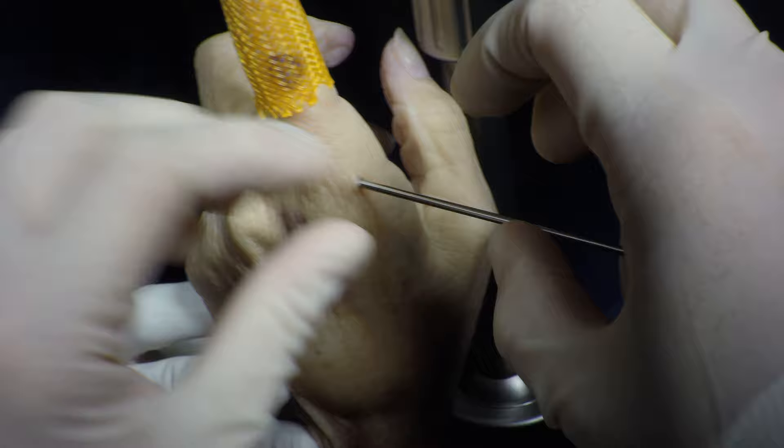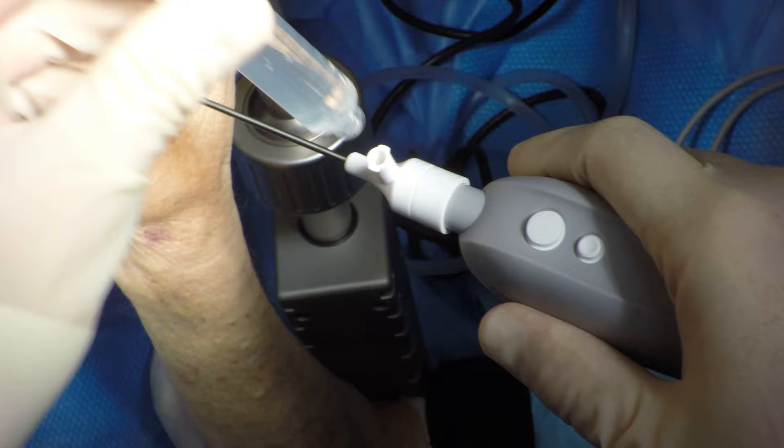The cannula for the Arthrex nanoscope is inserted — this is a 2-millimeter, 0-degree scope. A 10-cc syringe with saline is used for inflow. Because of the very short distance between the skin and the joint, when the scope is first placed into the joint with the OR lights on, the synovium can appear very red. If the lights are turned off, the color returns to a more normal appearing color.